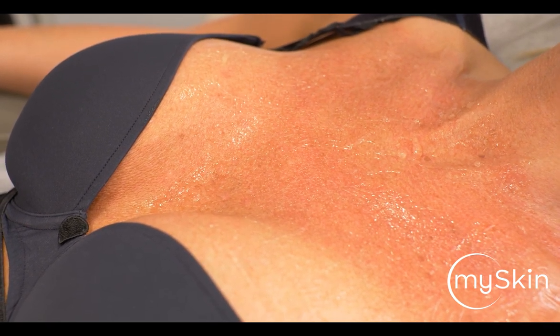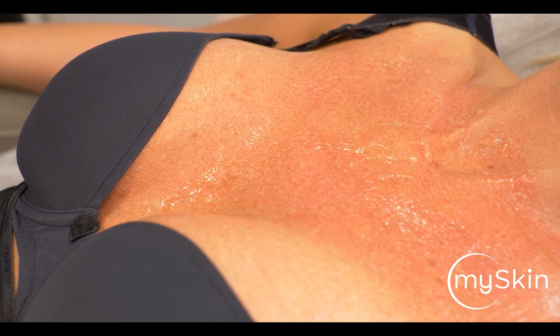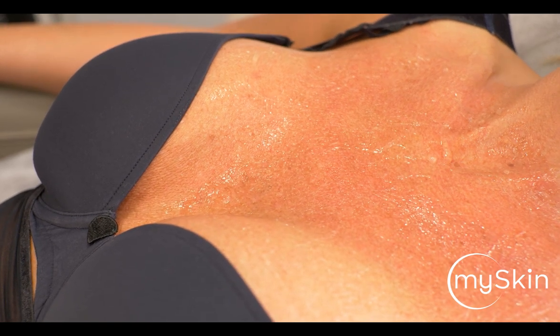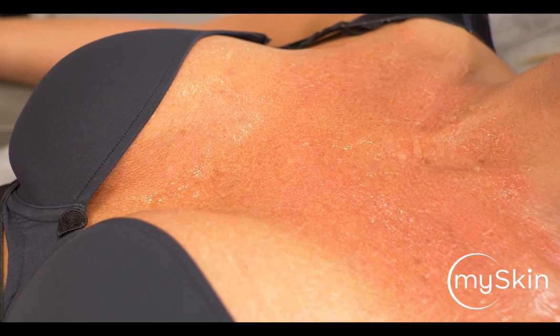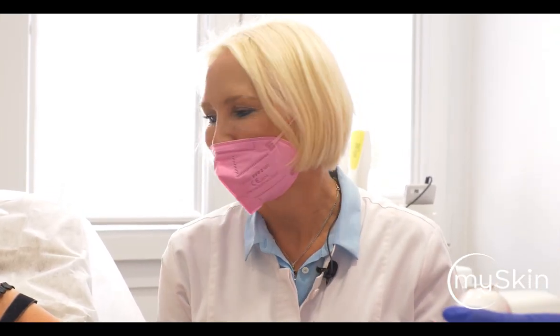We are going to apply a very nice calming mask, and this is something we advise to use at home also in the next 24 hours, so people can follow their normal activities — of course with sun protection — pretty much straight away after the treatment. For the chest, it's super important really not to over-treat and not to use too aggressive settings, because the skin is sensitive on the chest. Especially if somebody is rather slim and bony, we have the bony structures to consider, so it's very important not to over-treat.